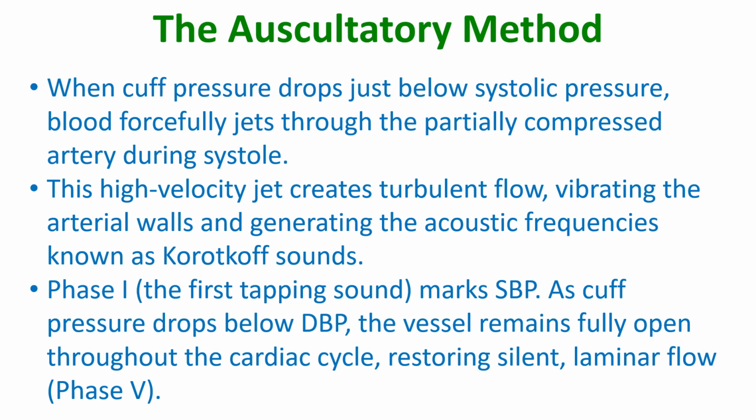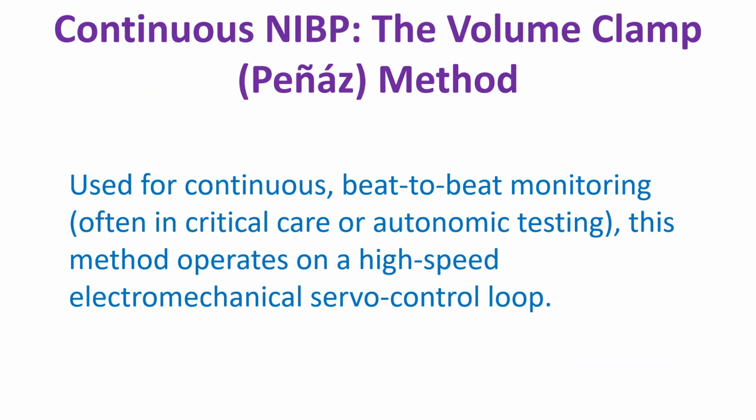As cuff pressure drops below diastolic pressure, the vessel remains fully open throughout the cardiac cycle, restoring silent laminar flow, that is phase 5. Continuous NIBP, the volume clamp method, is used for continuous beat-to-beat monitoring, often in critical care or autonomic testing like the tilt table test.